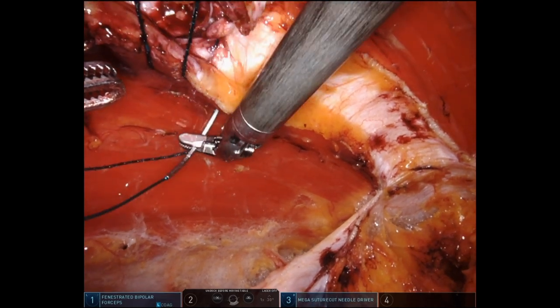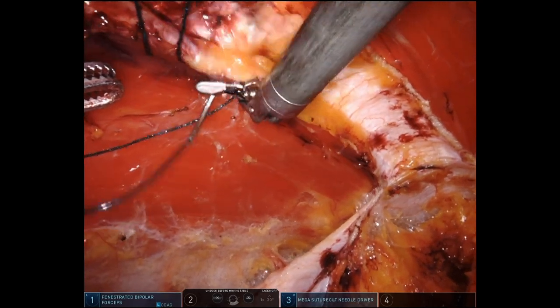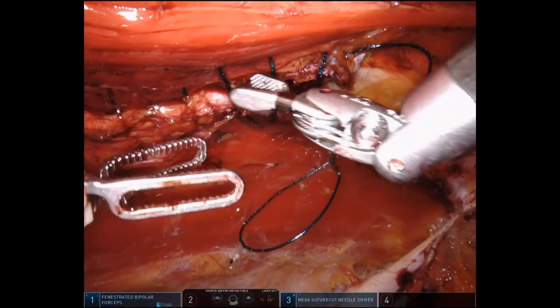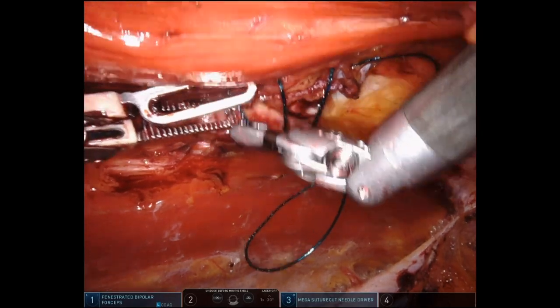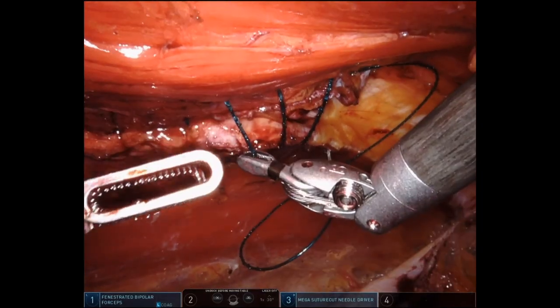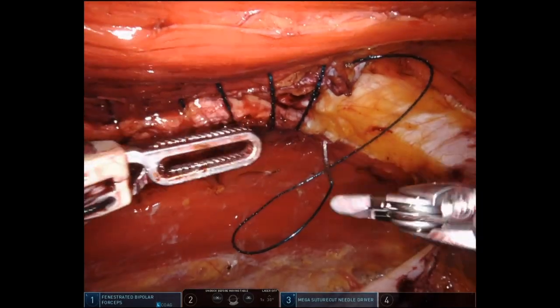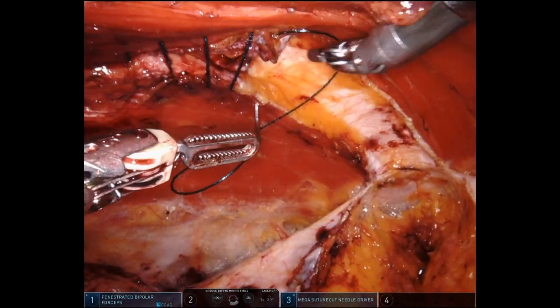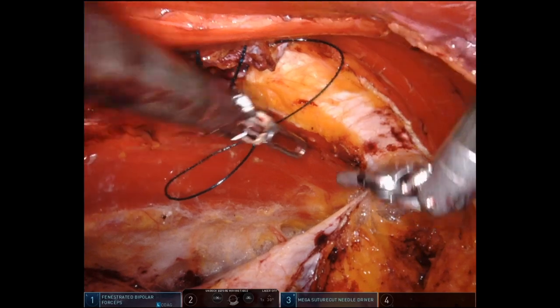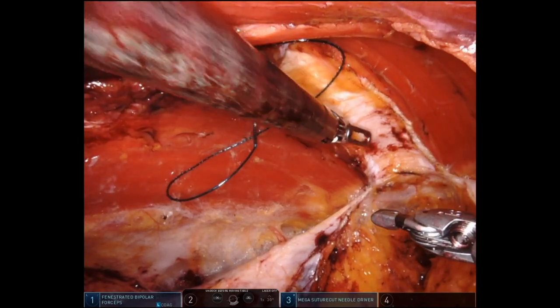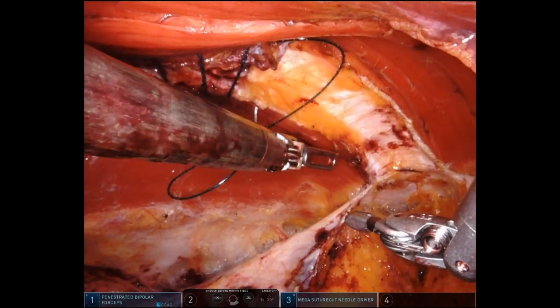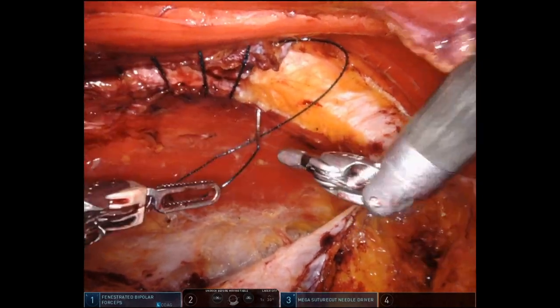I'm also going to have to proceed very slowly and fumble with the needle. My left hand — the fenestrated bipolar — is coming in at a very good angle. It's tangential, not perpendicular to the tissue.